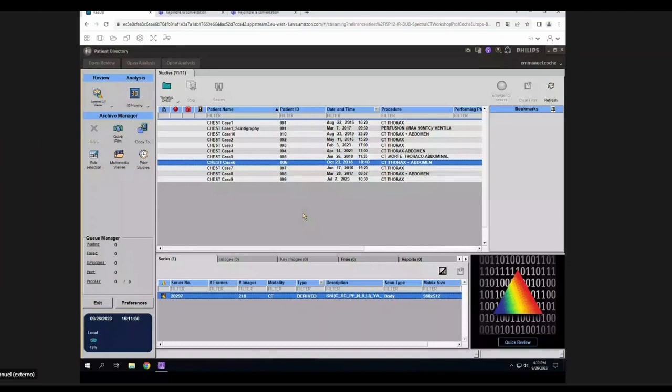And did you have the chance already to look at the electron density maps? Not on this case. We are working on that, inside the lungs, and we did some experimentation. But in the lungs, it's quite difficult to use electron density. It's decreasing the noise, but for characterization of material, it's quite difficult. It needs more experimentation. Okay, well, thank you for the answer.